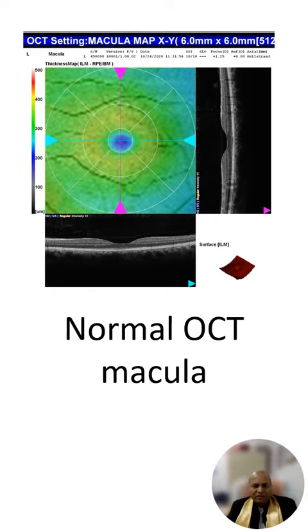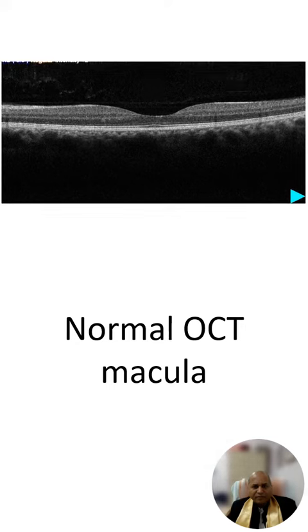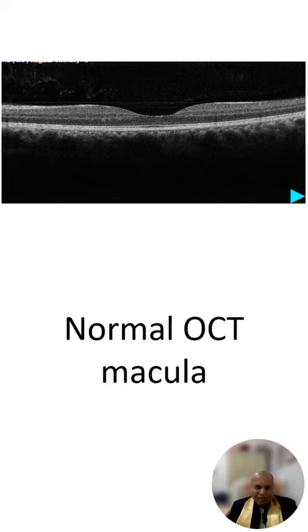Just for reference, this is a normal OCT. As you can see, there are distinct layers of the retina, and we can also see the foveal dip which is present in the macular area. This is absolutely normal, demonstrating all the layers separately, including the nerve fiber layer and the most reflective layers — the retinal pigment epithelium.